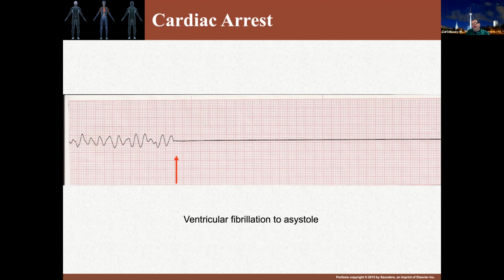Now, how do you detect asystole? Well, you have this flat line here. Now, by the way, I'm going to point out one other thing in this. If this were a normal rhythm, rather than the ventricular fibrillation that we see here, and this led up then to an asystolic event like this, and your little monitor went off, should you immediately start compressions in the heart of this individual? And the answer is, why don't you assess the patient?